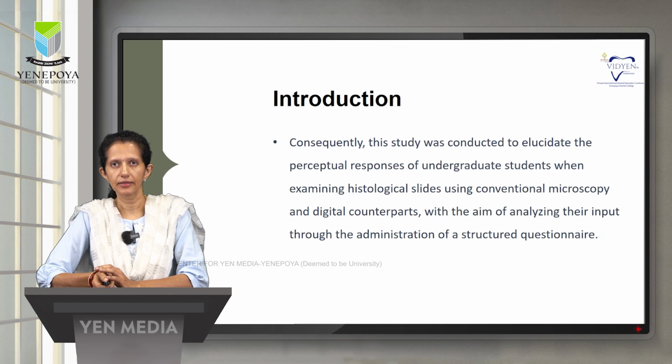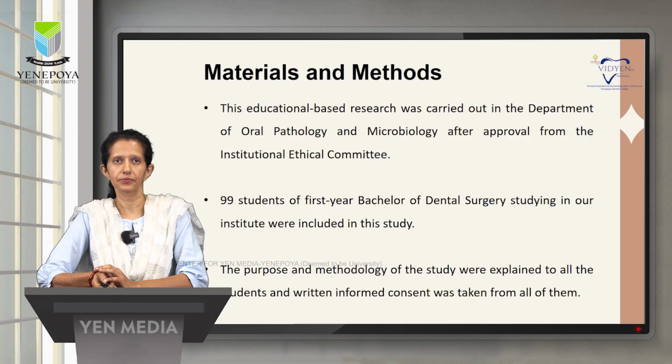Consequently, this study was conducted to elucidate the perceptual response of undergraduate students when examining the histological slides using conventional microscopy and digital counterparts, with the aim of analyzing their input through the administration of a structured questionnaire.